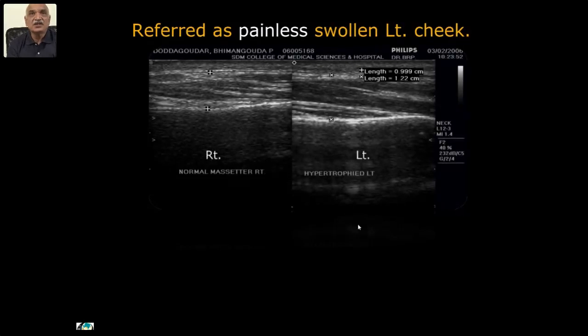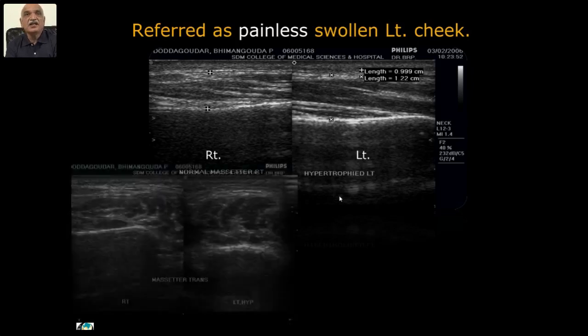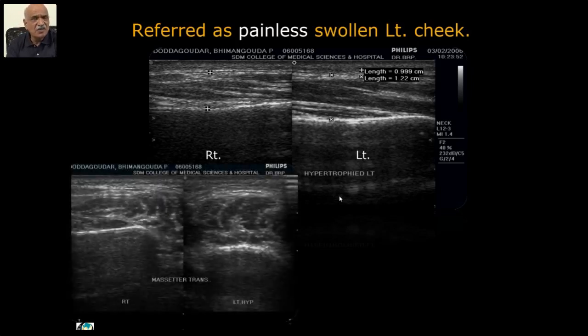Referred as painless swollen left cheek: the right masseter is normal and the left masseter is swollen — measurements confirm it is thicker — but this is benign hypertrophy. The left masseter is a not very common condition, but when the referrals are there you will find it.